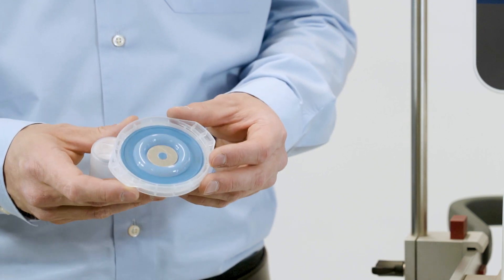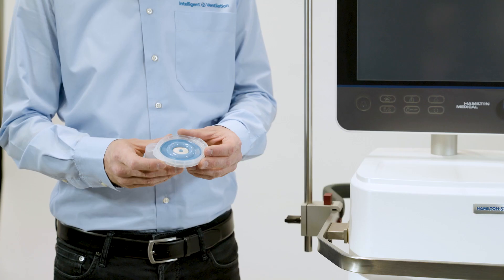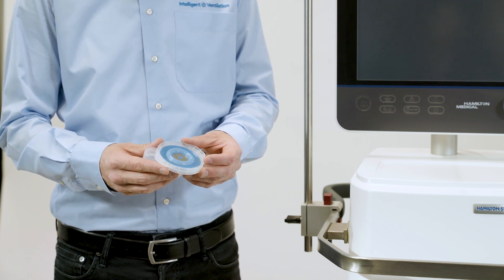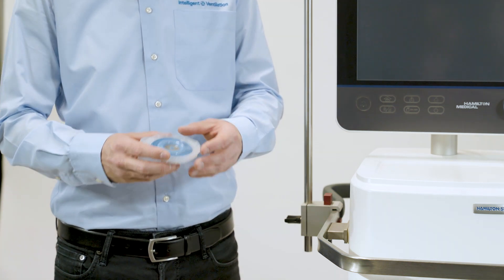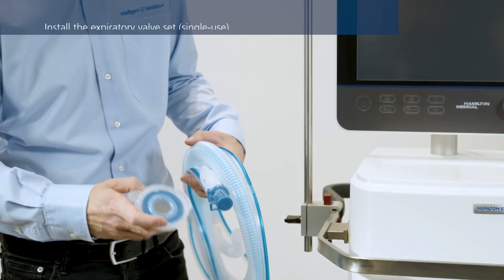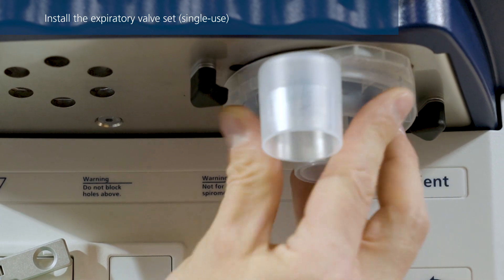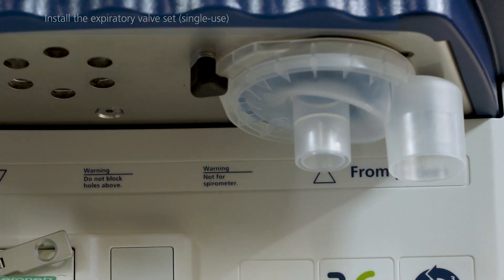In a single-use expiratory valve set, the membrane is permanently attached to the expiratory valve body. Do not remove, tug, or pull on the membrane. Position the expiratory valve set in the expiratory port and twist it clockwise until it locks into place.